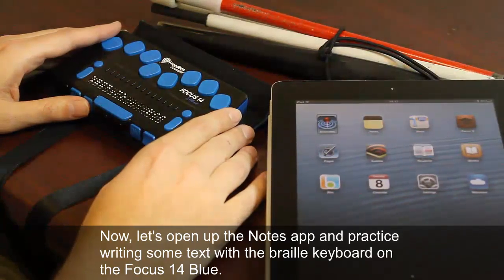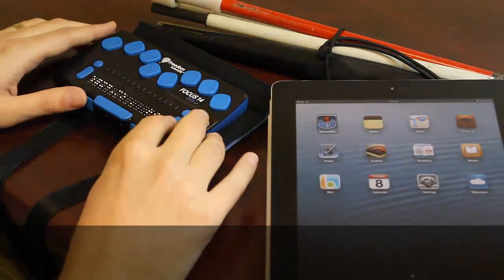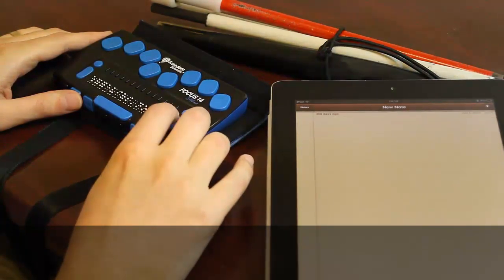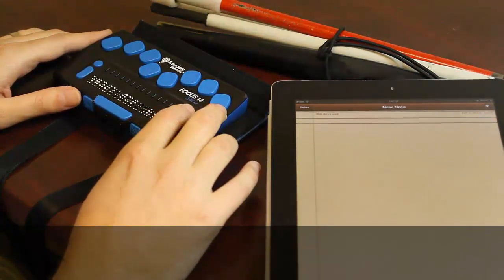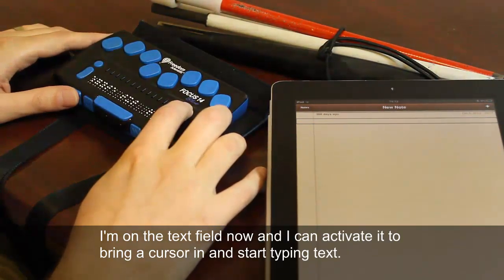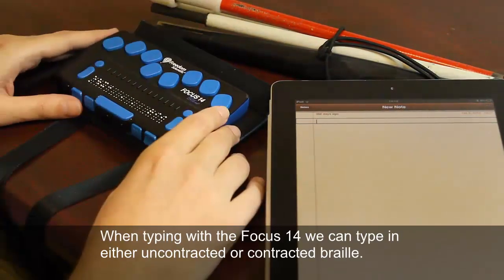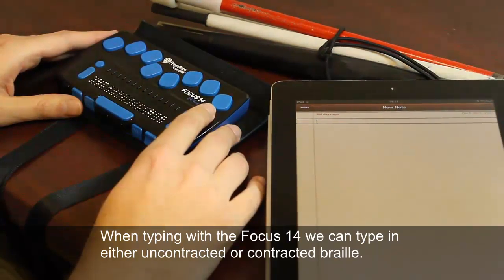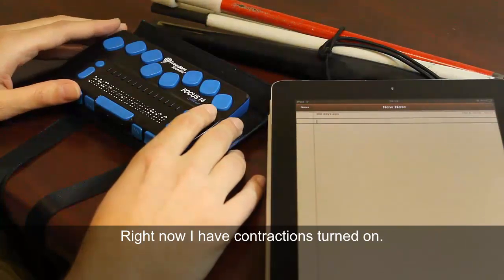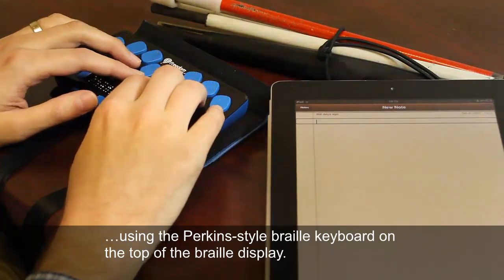Now let's open up the Notes app and practice writing some text with the Braille keyboard on the Focus 14 Blue. I'm on the text field now, and I can activate it to bring a cursor in and start typing text. When typing with the Focus 14, we can type in either uncontracted or contracted Braille. Right now I have contractions turned on. I'll type some text using the Perkins-style Braille keyboard on the top of the Braille Display.